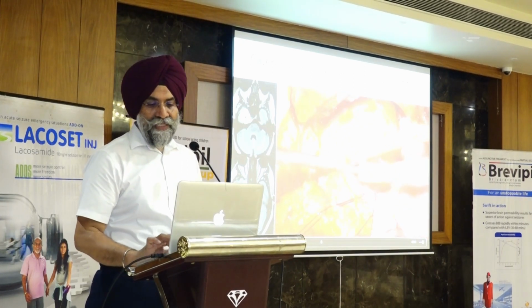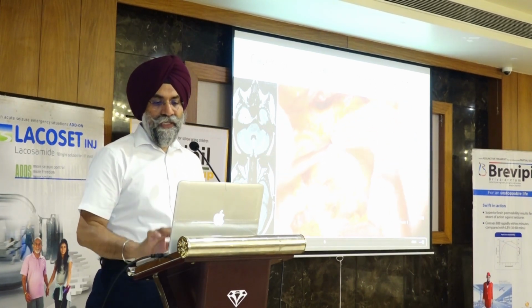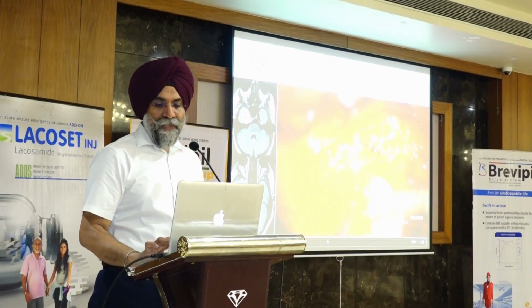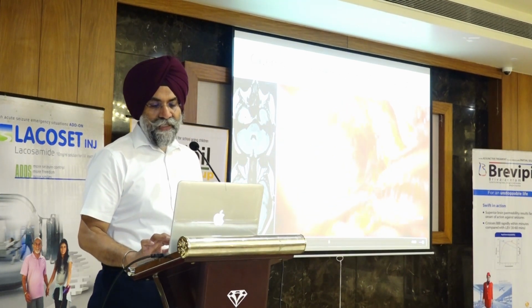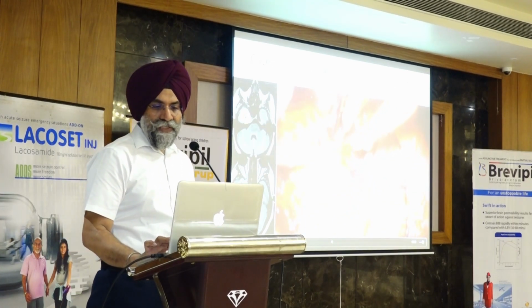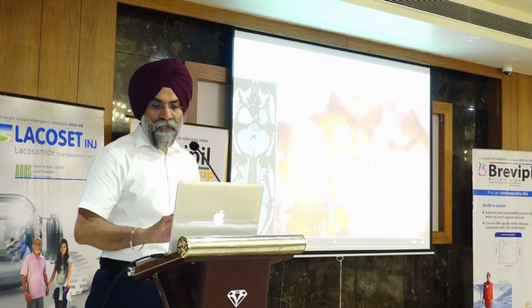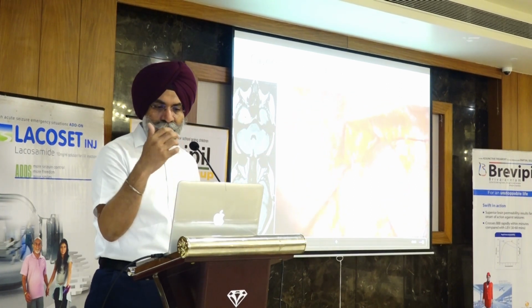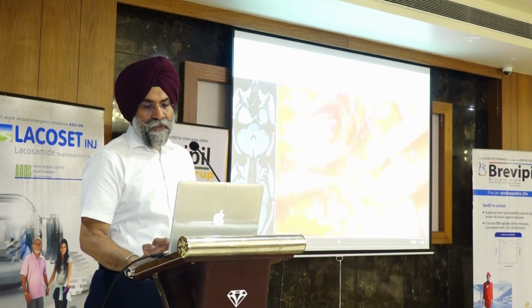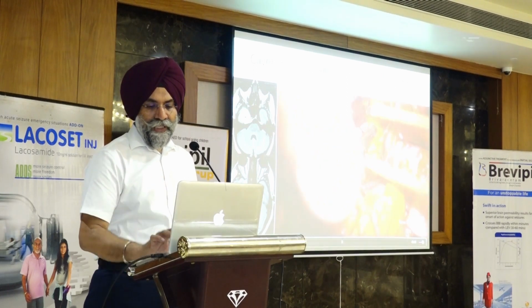CSF is coming. Then once you have dissected it all around, you start coagulating. Once you start coagulating, the tumor starts shrinking also. Whatever bleeding is there, usually it is venous in origin and can be easily controlled. So you see that, once you are coagulating, the tumor is clearly becoming more pliable, more manipulable. Now you see that it has lost its turgidity as we are coagulating more and more.